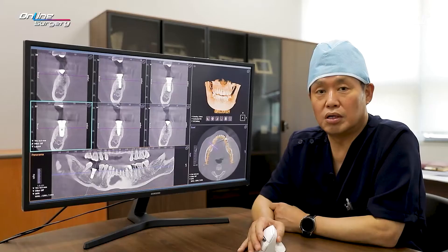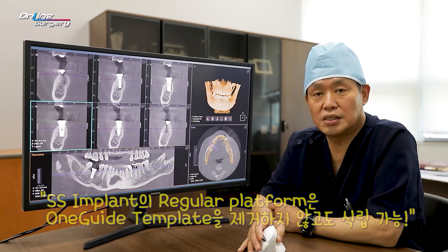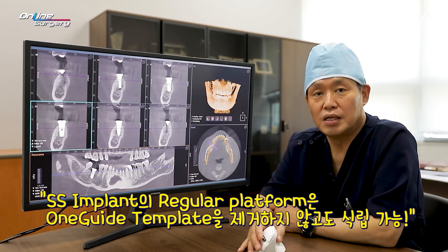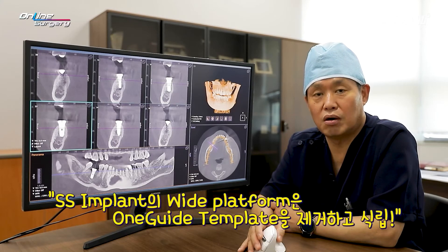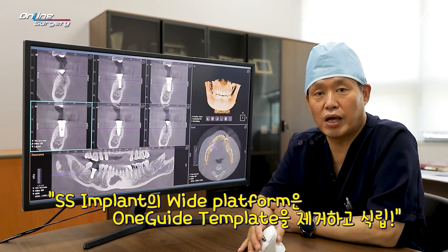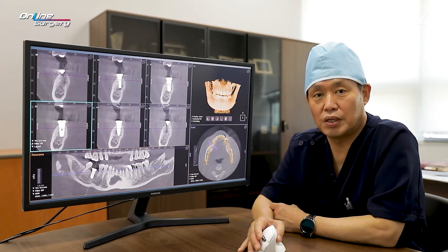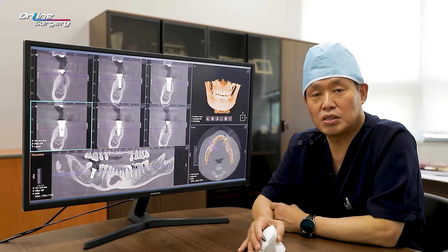In the surgical video, I'm going to use the SS type implant. In this case, if you use regular platform, you can use it with the one guide template on. However, this was a posterior case and wide platform was planned. One guide was used for drilling, and after that, when the SS implant is placed, the template was removed and the implant was placed in position. Let's look at the surgical clip.